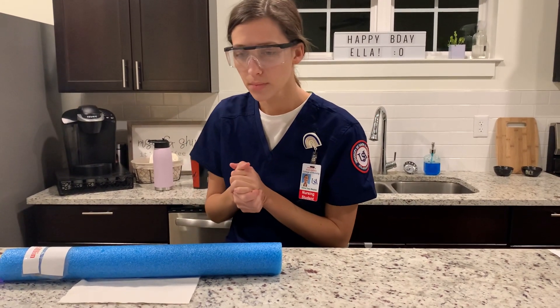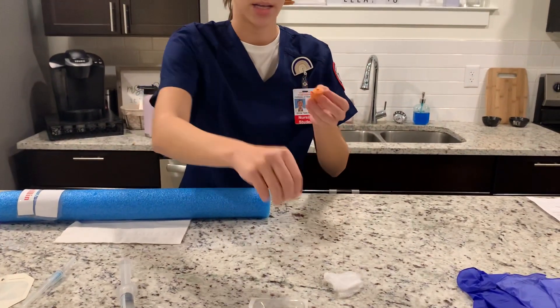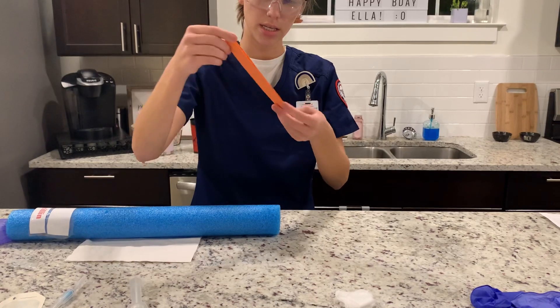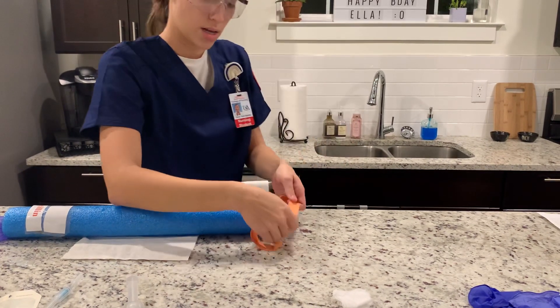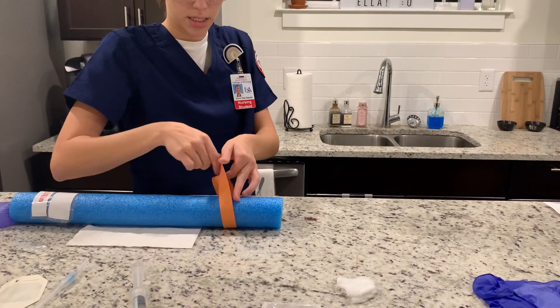Now I'm going to apply the tourniquet. I'm going to place it about four to six inches above where I plan to insert the IV.